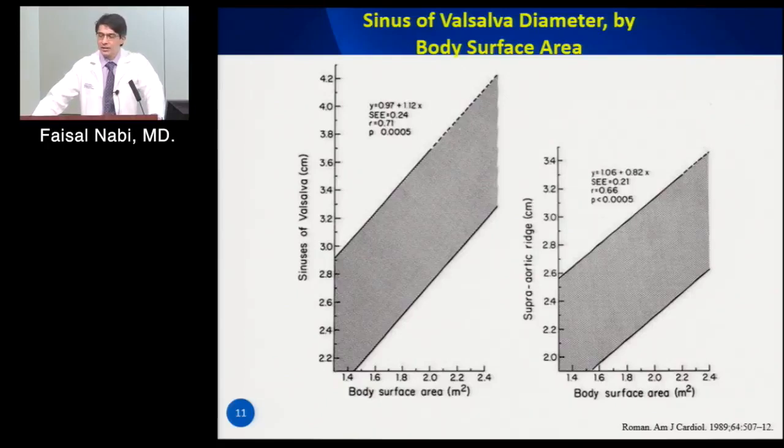But if you're measuring the aortic root, as we often do with echo or CT, there's actually a Z-score you can calculate from the Marfan's website. And I think it may be of interest to the referring surgeon to know, as a standard deviation, how this patient's aortic sinus relates compared to a large population. So I just recently came across that, and I was sitting there Googling it, and it's very easy.